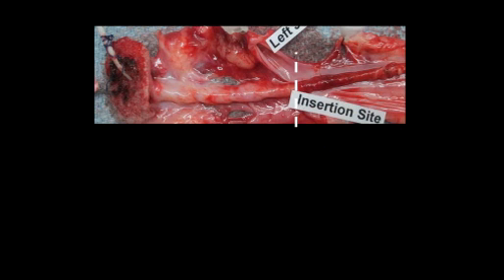And here you see that. This is not from the current study, but another study where I have done an en bloc dissection and removed the entire length of the catheter. You see the skin here on the left, and the catheter is still in place. But directly underneath the skin, we see this lengthy subcutaneous space in which we have literally a fibrin or collagen sheath around the catheter. This sheath is continuous and contiguous with the fibrin sheath within the vessel.